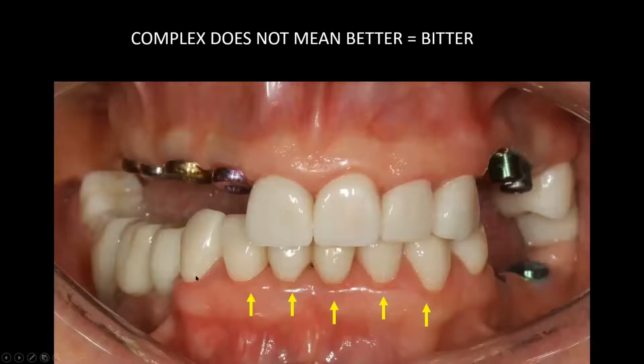Stan, I asked the dentist for a perio chart. He didn't do a charting. He's restored all his bottom teeth everywhere. Why were those back teeth taken out? Was that because of periodontal treatment or periodontal problems that he had there? Why did they take them out? That's a good question.